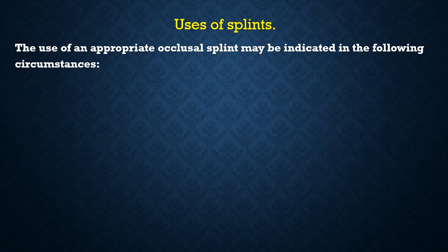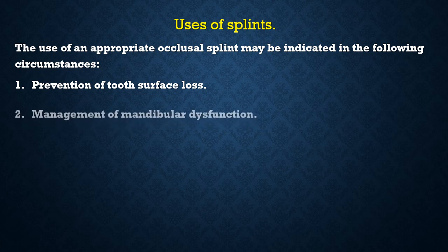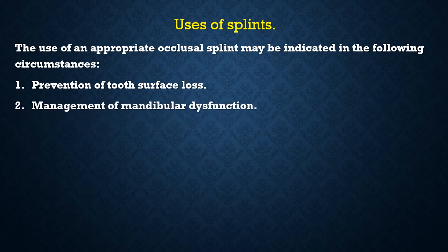Well, the uses of splint. Actually, the splint may be indicated in the following circumstances. First, prevention of tooth surface loss, especially in those patients who have night bruxism.